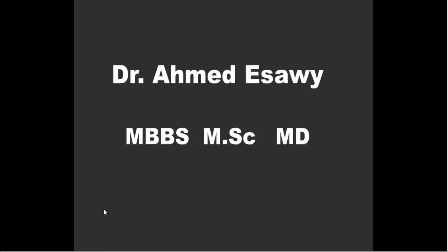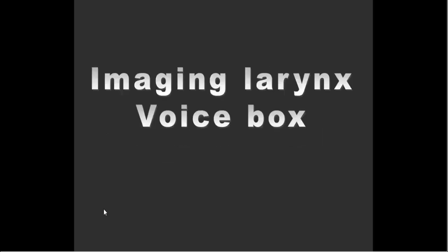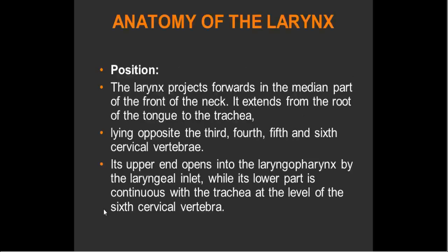Bismillah ar-Rahman ar-Rahim. We talk in this lecture about imaging of the larynx. The larynx is the voice box.